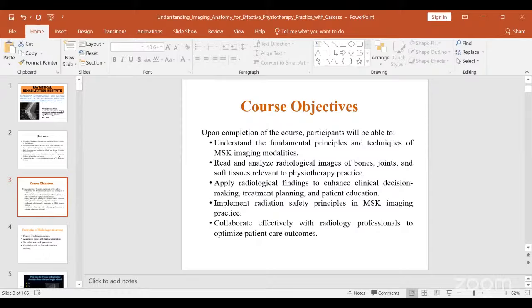That diagnostic in nature doesn't mean that those images must be excellently beautiful. So please put this at the back of your mind. Sometimes you receive images that are poor in quality or not sharp, so to say. It's because we are having a trade-off in what? Limiting the radiation dose, which is more consequential than just the primary diagnosis the patients have.